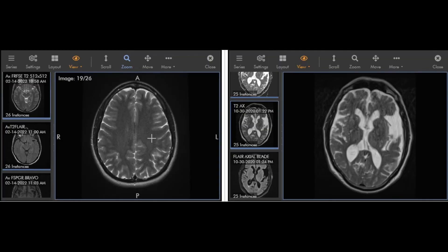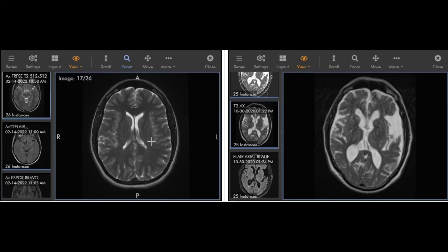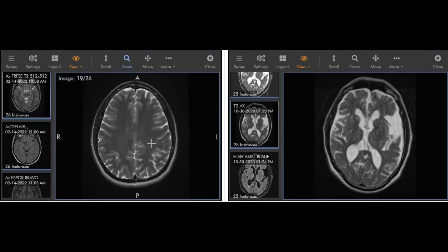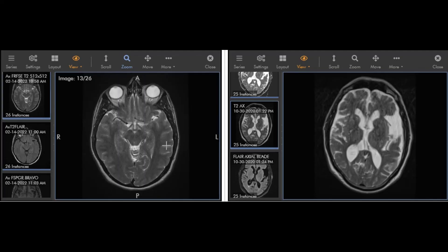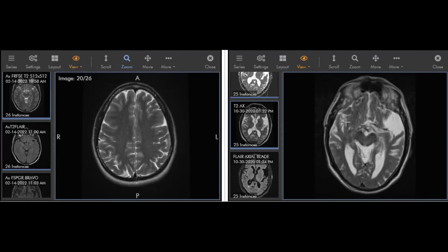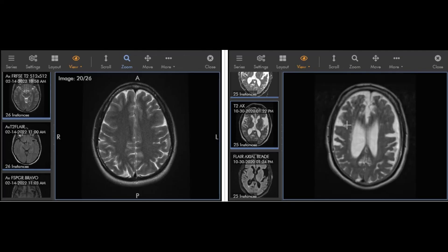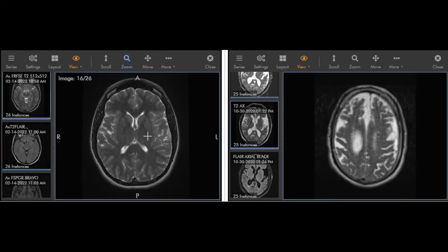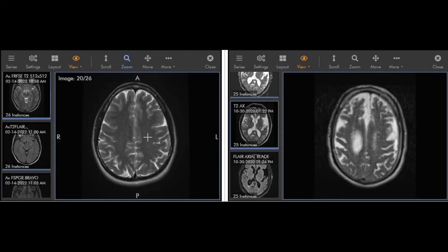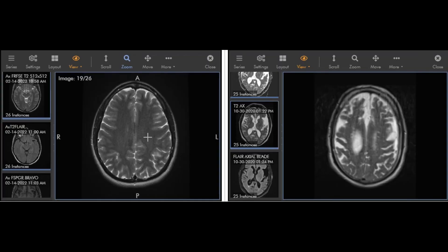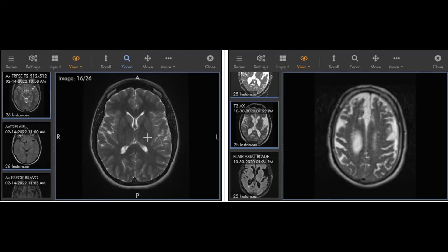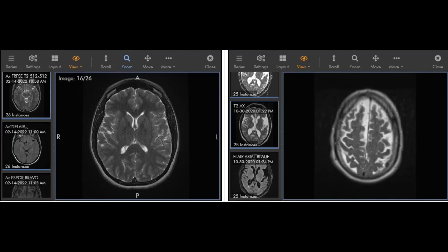Very rarely, they may mention central versus peripheral volume loss. So central meaning losing volume here in the middle, as I showed before with these ventricles getting larger. And you can see that again here on this example, or peripheral meaning that the cortex itself has lost volume. And on this example, we'll see, there's a lot of volume loss in this one. So sometimes you will see that in a report as well. And that can sometimes have different effects as far as symptoms and clinical syndromes as well. In any case, this is a normal and this brain has severe volume loss.